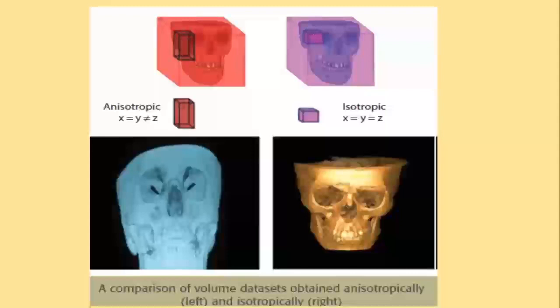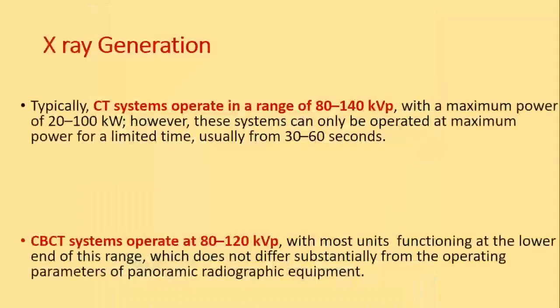I should not totally blame somebody there, but you should know, though we call it isotropic, honestly, a lot of studies, especially in the last 2-3 years, have thrown figures that have told us it's not really isotropic. There could be margins of error. So for people who are reporting, it's good to overestimate slightly than underestimate. That's the issue with isotropic and anisotropic voxels.